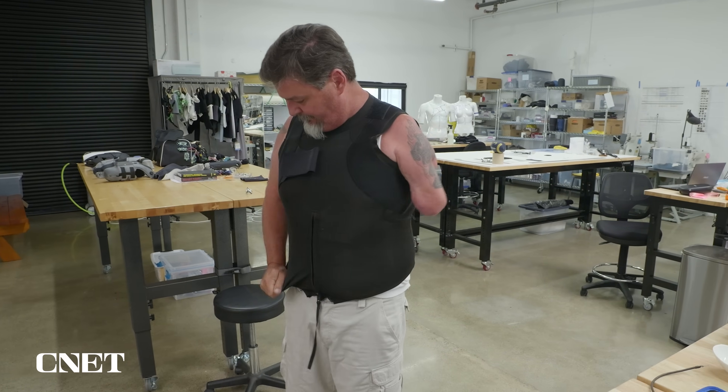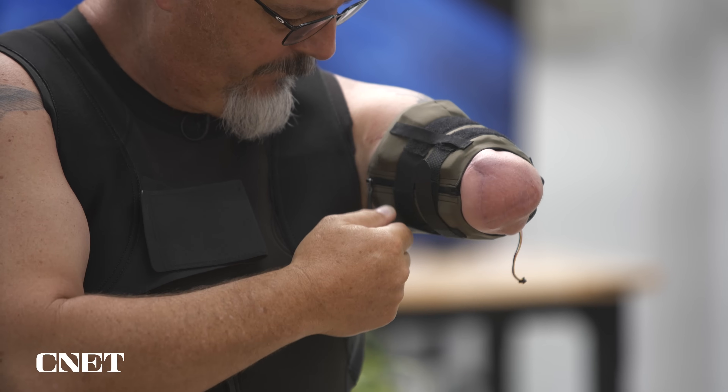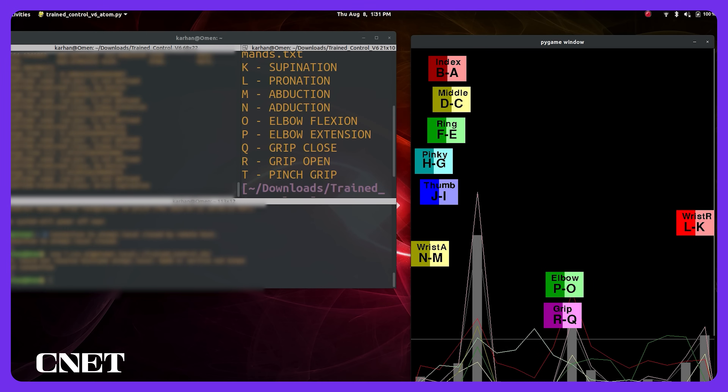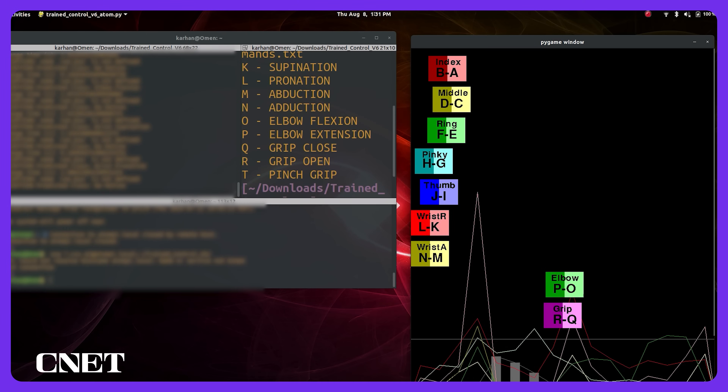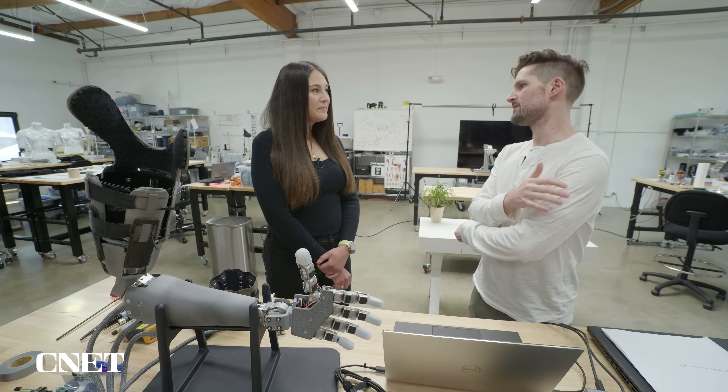A user puts on a special shirt, then a cuff over their residual limb. Electrodes inside measure muscle activity via EMG, or electromyography, so you can control the arm's movement.